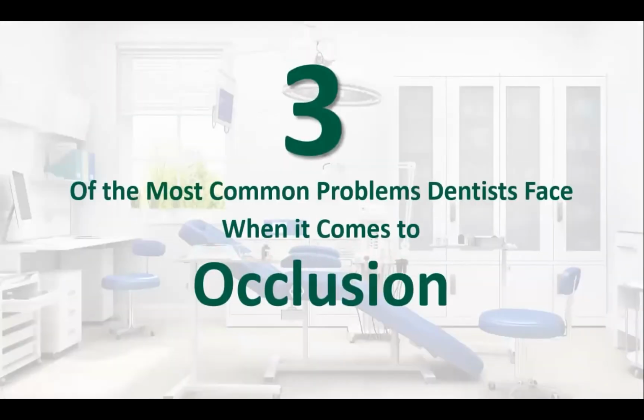So first, let's talk about problems. We've spent countless hours speaking with dentists in their offices, talking to you at numerous continuing education courses and venues, speaking to prominent experts in the field of dentistry, and learning from our network of key opinion leaders around the world. This led us to the identification of three of the most common occlusion problems dentists experience.